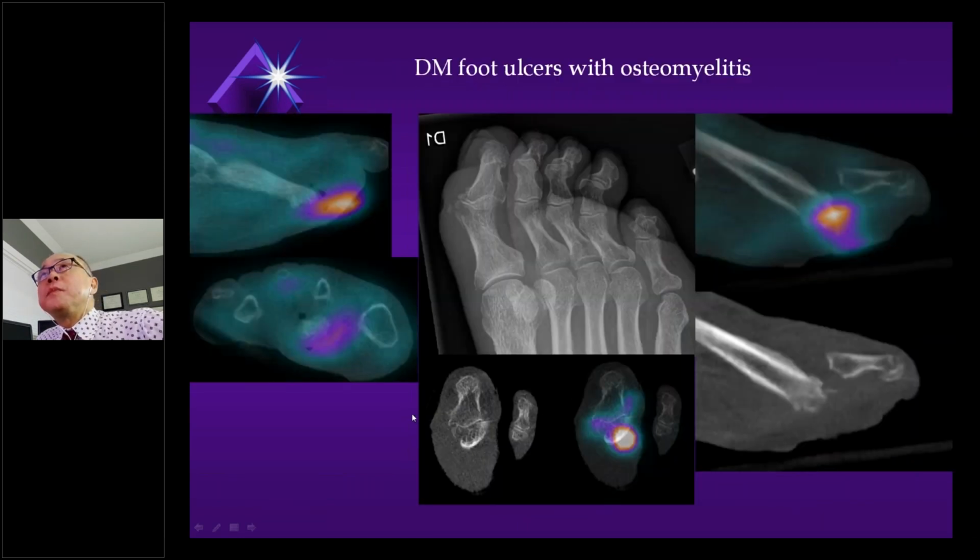And some examples of just outright deep osteomyelitis in a diabetic foot ulcer. This one is very deep. This is the bone contour. Perhaps there might be some disagreement, but I would call that infected. It appears to cross the bone contour. I will call that infected.